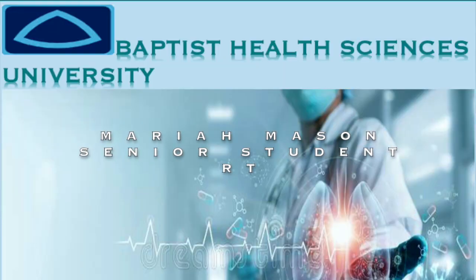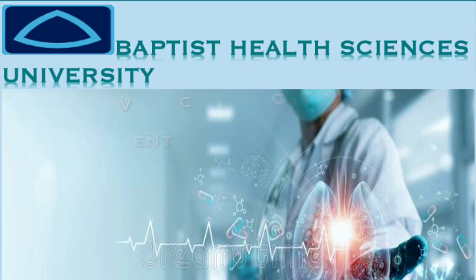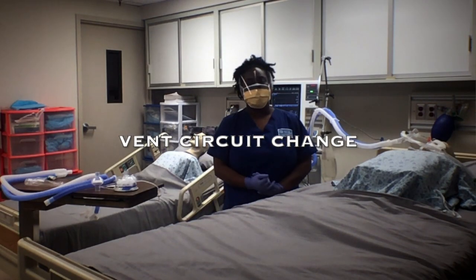My name is Mariah. I'm a student respiratory therapist at Baptist University of Health Sciences. Today I'll be doing a vent circuit change.